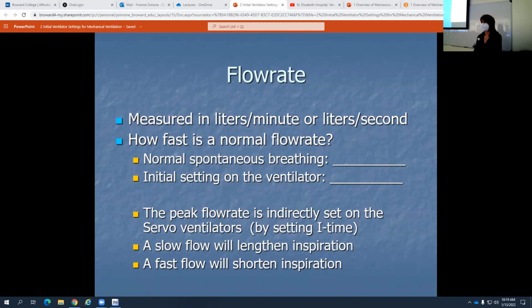Patients, especially young patients, when they're in septic shock, they have a really bad pneumonia, their minute volumes will be so high. They'll be breathing 30 times a minute. Their tidal volumes are huge. So their minute volume, I don't know, it could be 20 liters a minute, 30 liters a minute. I mean, they're breathing really fast. So when a patient is breathing really fast, you need to give them the air faster. You can't set the flow at 40 liters a minute if they're breathing in at 100 liters a minute.